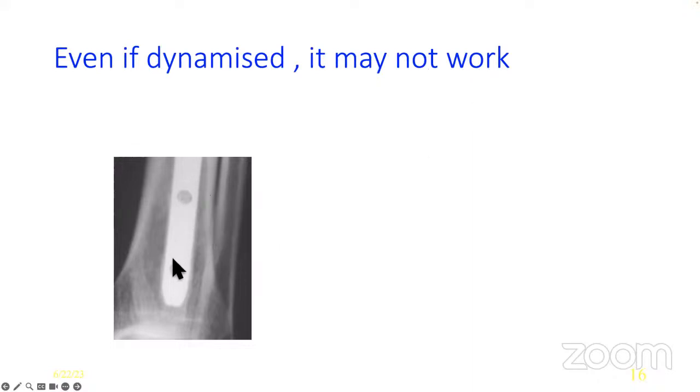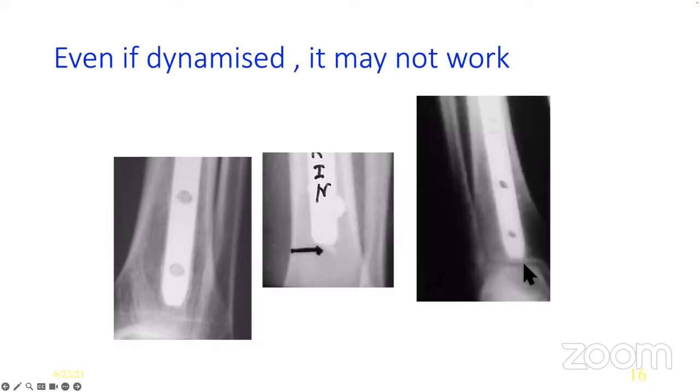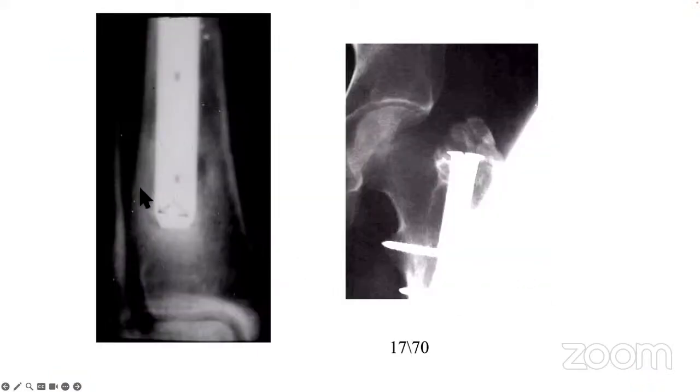If there was a screw in one of these holes but the other hole is filled up with bone, then it cannot allow dynamization. Or if a piece of bone from the fracture site has traveled down, this will form a block, so the nail will not travel down. Or it is subchondral, as I mentioned to you earlier. Or there is a bone plug that has formed already here. You can see there is too big an amount of bone formed at the end of the nail. So even if it is dynamized, this will not be effective.